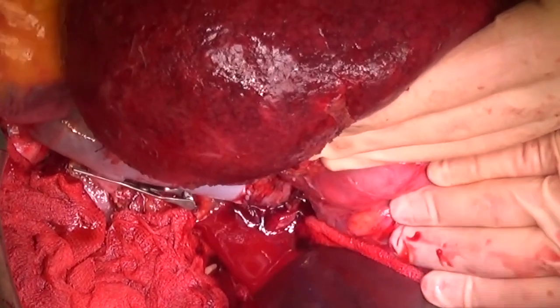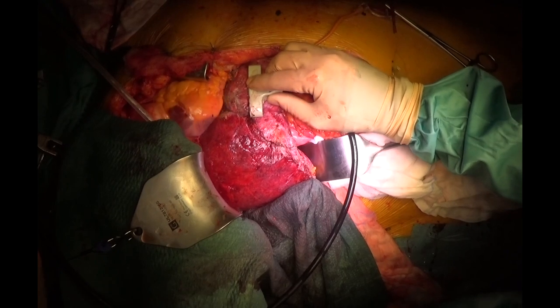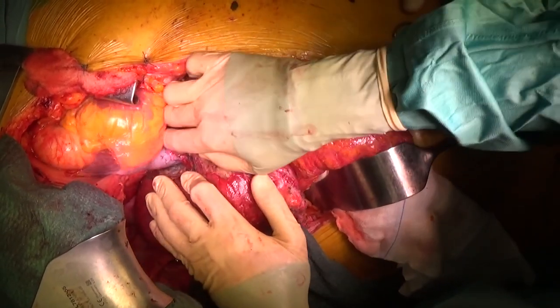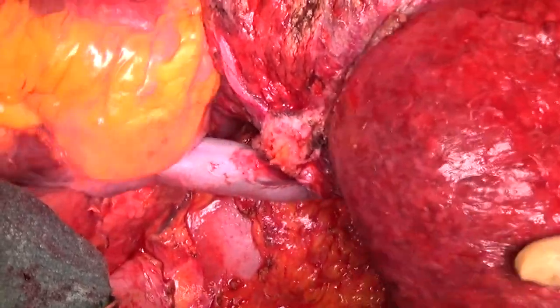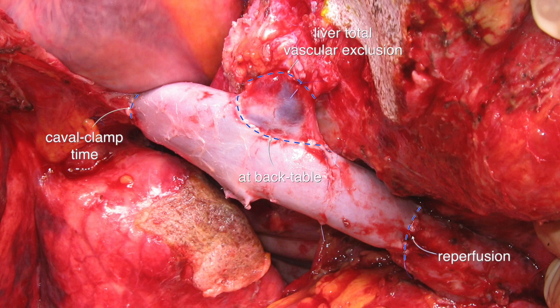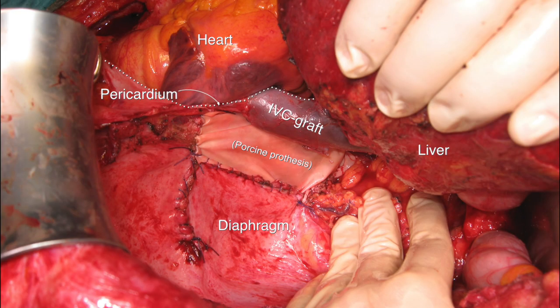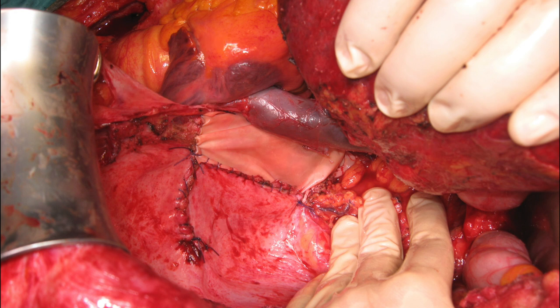Intraoperative ultrasound documented good liver perfusion and regular patency of the anastomosis. This is a final view with reconstruction completed. Only the proximal anastomosis between the intrapericardial IVC and graft was realized during complete caval exclusion. It was necessary to reconstruct the diaphragm with direct suturing and with the interposition of a porcine pericardium patch.